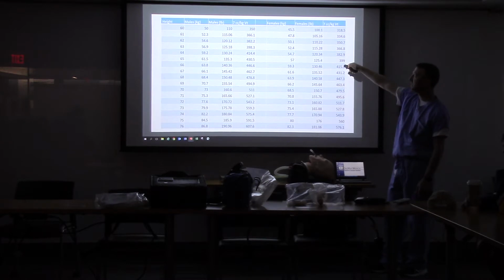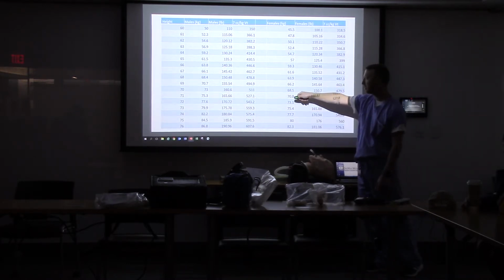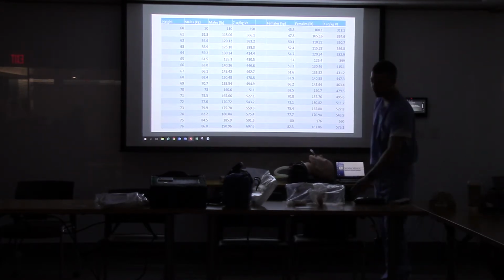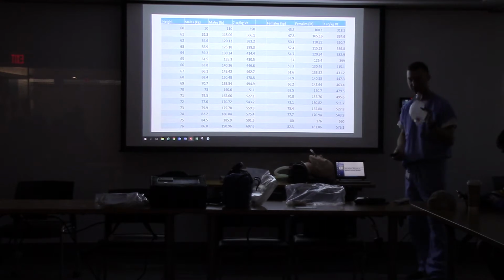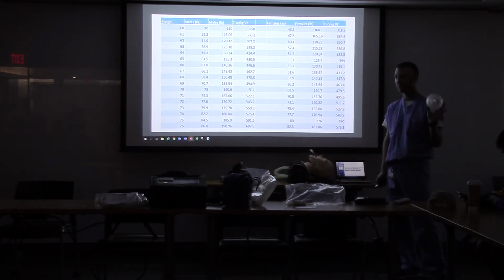And at 7 cc's per kilogram, which is in the middle of the 6 to 8, my ideal breath is around 527. Well, if you remember from my BVM study that we did a couple years ago, a single finger pinch with this BVM is about 800 cc's per breath.